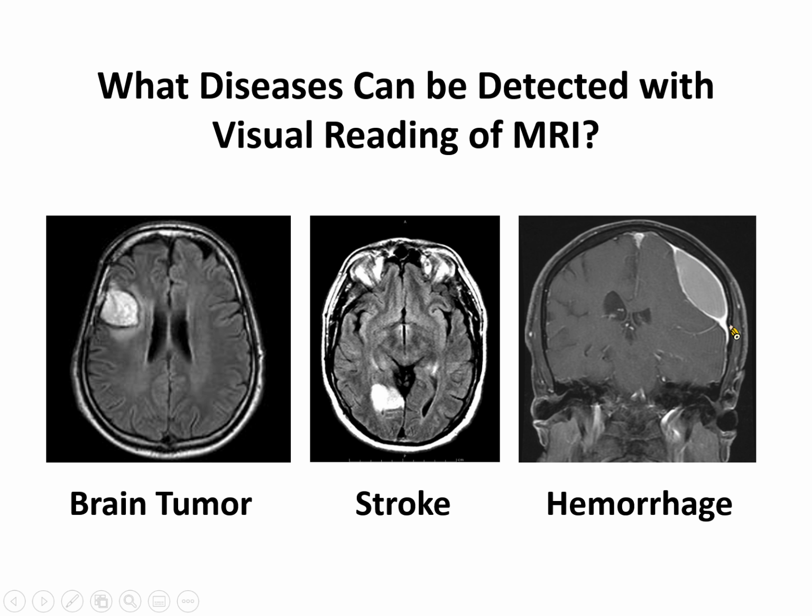You can see this brain hematoma, which is an accumulation of blood, compressing the brain tissue, and it will result in some neurological symptoms. That's a huge advance, because in the past, without MRI, we could only guess what happened inside the brain. But with the MRI, we can make the diagnosis and give the necessary treatment. So that is the useful part of the MRI.